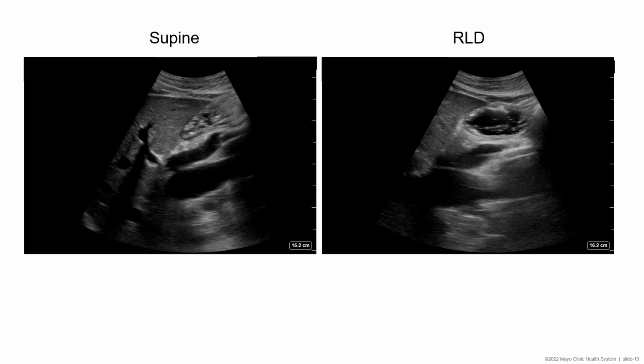I drank 250 mLs of water here. On the right, we see the image in the right lateral decubitus position. It is the more classic starry, starry night image of clear liquids.